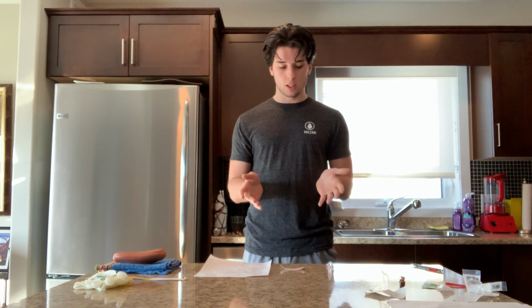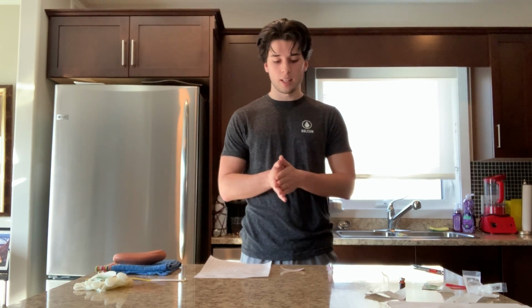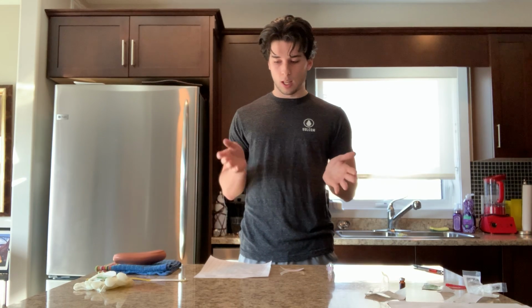And once I've checked all that, I'm going to select my site of injection. So for this subcutaneous injection of only 1 milliliter, I'm going to be injecting into the abdomen. To landmark for this medication, I will be finding their umbilicus or their belly button, and I'll be going 5 centimeters directly out to the side. So kind of in between the upper and lower right quadrant. I'll be going directly 5 centimeters away from the belly button. So once I have landmarked and chosen my injection site, then I am ready to go.